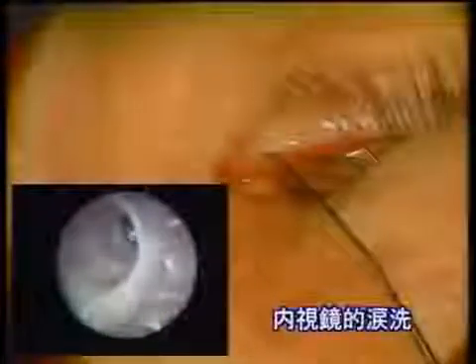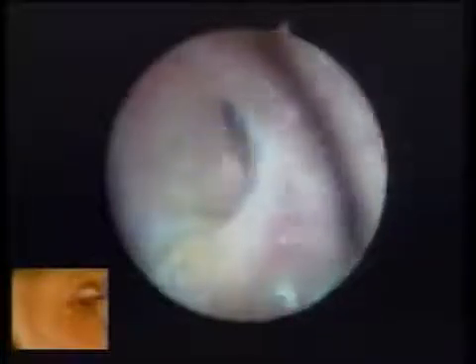This is an endoscopic irrigation 436 days postoperatively. Fluid is flowing from the new large opening.